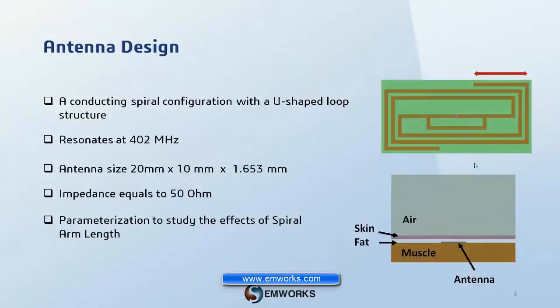So our antenna today will be a spiral antenna, this to be able to create a very long antenna in a small surface. The dimension of the substrate is 2 centimeters by 1 centimeter, and the thickness is 1.65 millimeters. The material of the substrate is Rogers with a permittivity of 10.3. And our antenna will be implanted inside the body between the skin layer and the muscle layer, and it is protected by a material, called the superstrate, just to protect the human tissue from any arcing or any short circuit.